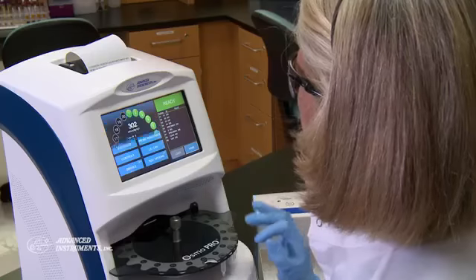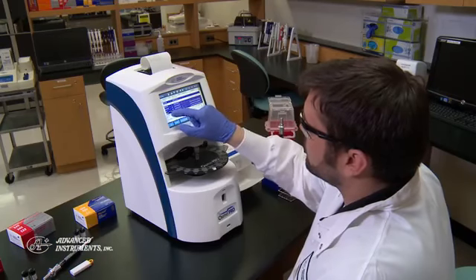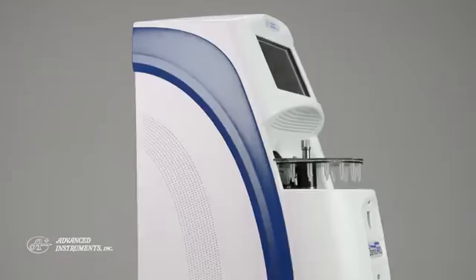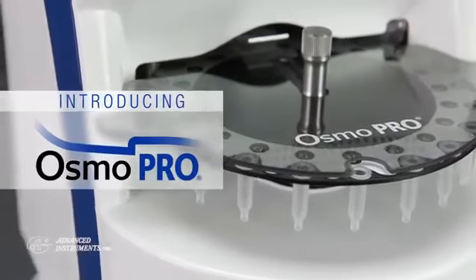You're passionate about delivering accurate test results with confidence and efficiency — so are we. We've taken our clinical diagnostic expertise to the next level by developing the ideal osmometry solution for today's busy laboratories. Introducing OsmoPro from Advanced Instruments.